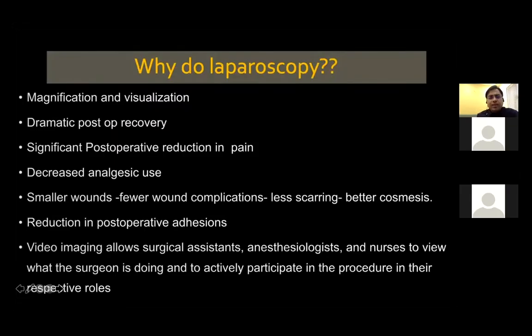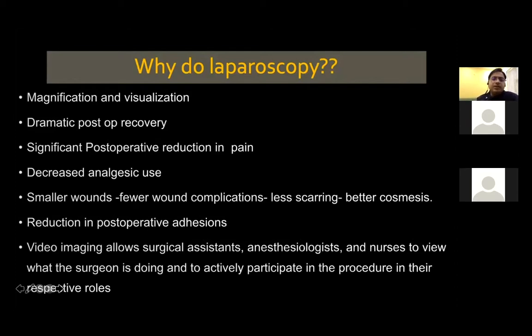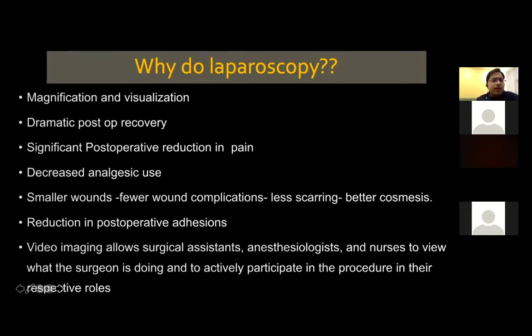But if you ask me, why do you want to do laparoscopy? If a single question is asked, the categorical answer will be the magnificent visualization that you achieve in the laparoscopic milieu. The recovery is dramatic, postoperative pain is substantially less, smaller wounds heal well, and video imaging allows better learning. So you must do laparoscopy.